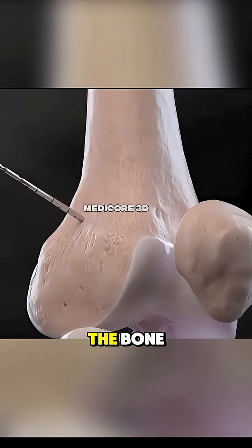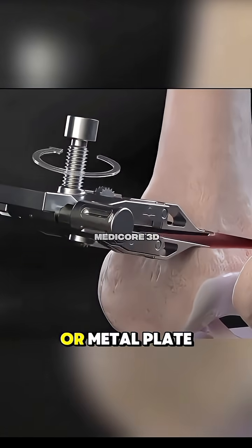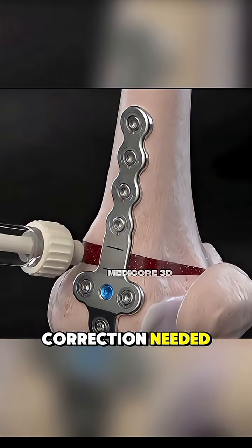A precise cut is made in the bone, and it's either opened to add a wedge of bone graft or metal plate, or closed to remove a wedge, depending on the correction needed.